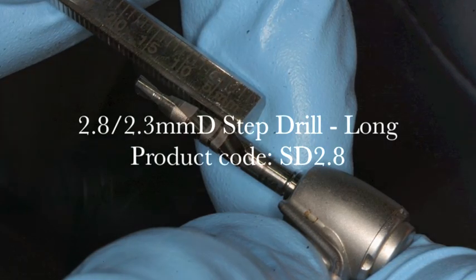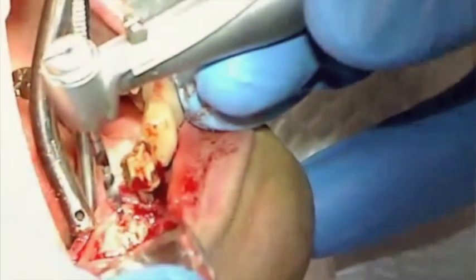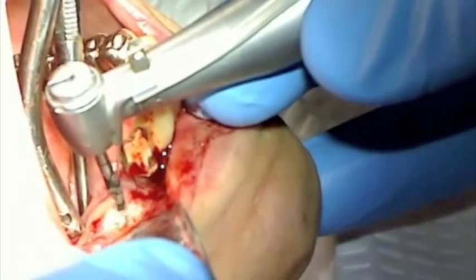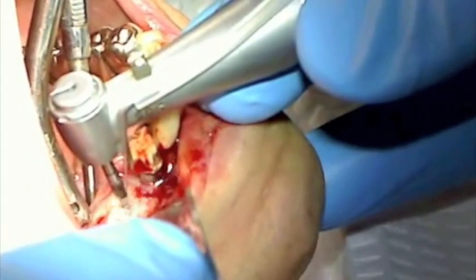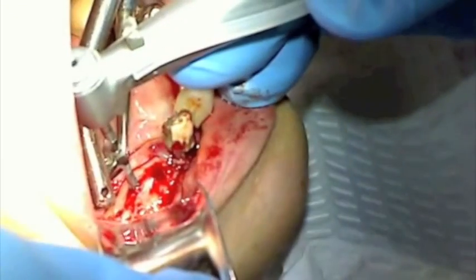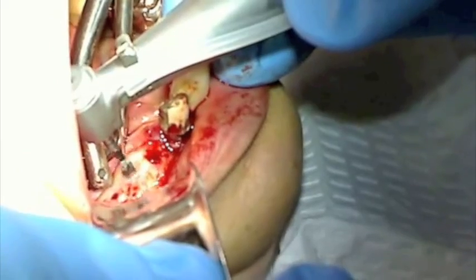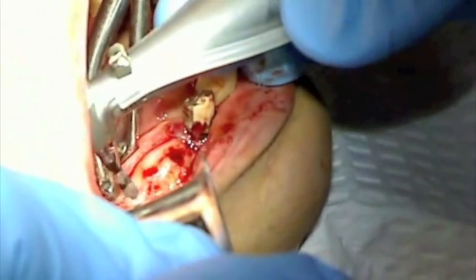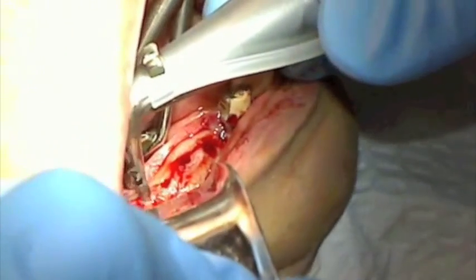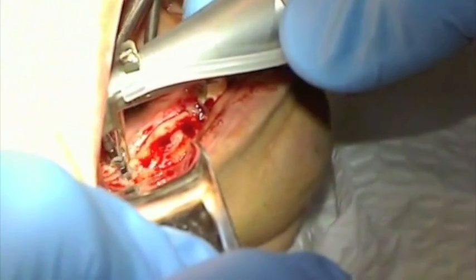Next, the 2.8-2.3 millimeter step-down drill is used to prepare each osteotomy to its respective length and diameter. Stopping at the 13 millimeter line, as you see here, prevents damage of the mental foramen. Each osteotomy is prepared to its respective length. Tactile sensitivity and speed of the drill allows you to efficiently prepare the osteotomy without overheating the bone.